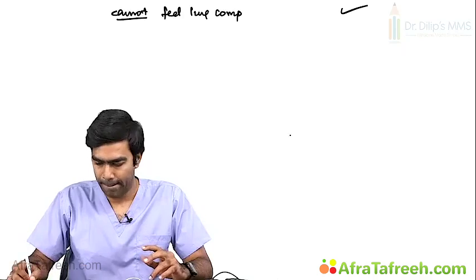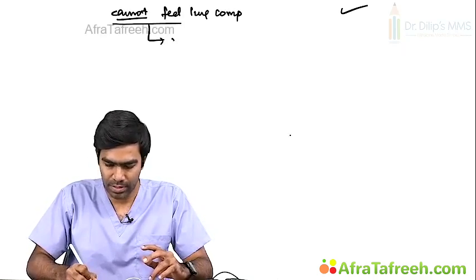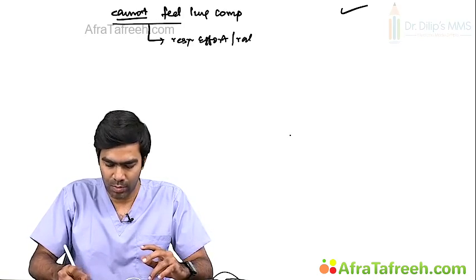Next, similarly, a self-inflating bag cannot feel the patient's respiratory effort, rate, or tidal volume. All these things are very difficult to feel in a self-inflating bag, whereas you can feel all of them in a flow inflating bag. When a patient inspires spontaneously, this bag will collapse automatically if the mask is of a tight fit. So yes, it can feel the respiratory effort of the patient, the rate of respiration, and the tidal volume also.